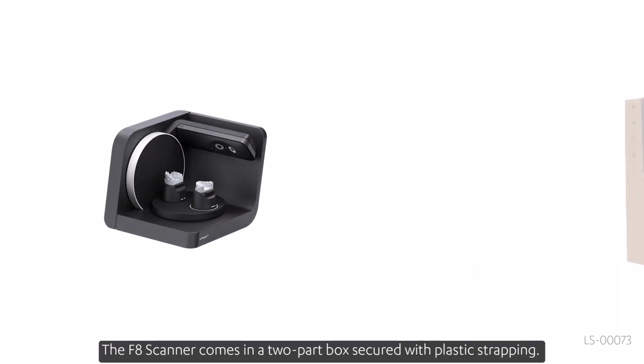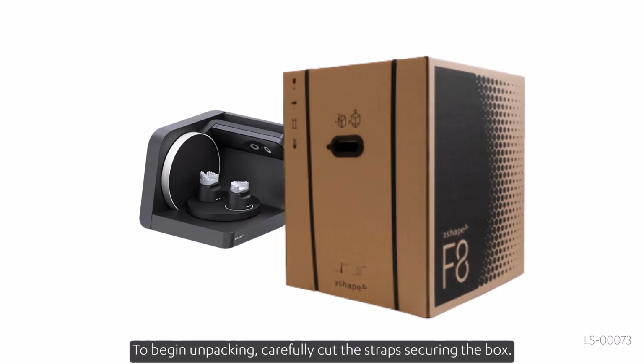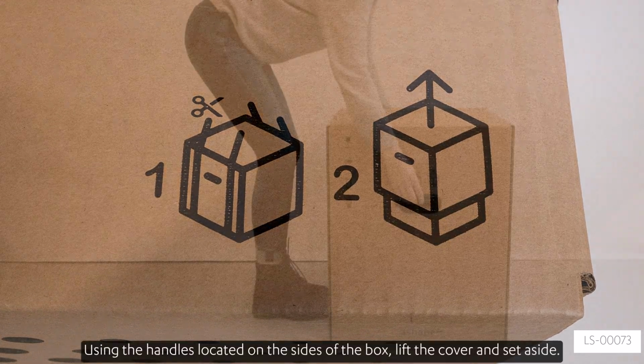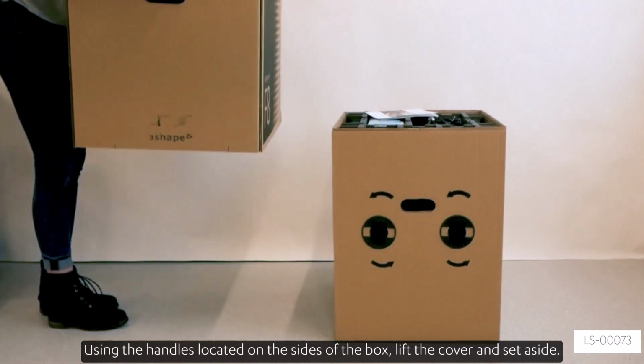F8 scanner comes in a two-part box secured with plastic strapping. To begin unpacking, carefully cut the straps securing the box. Using the handles located on the sides of the box, lift the cover and set aside.